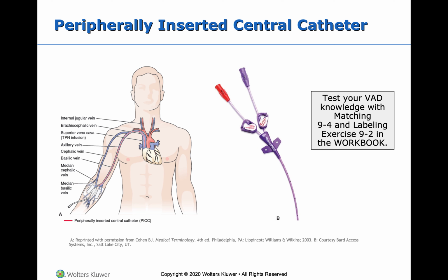So there's more chance of things going wrong with a PICC line than either of the other two, but in certain cases, some patients really need these. Something else I would like to say about this: when you are trying to draw from a patient that has a PICC line, that's your first step.